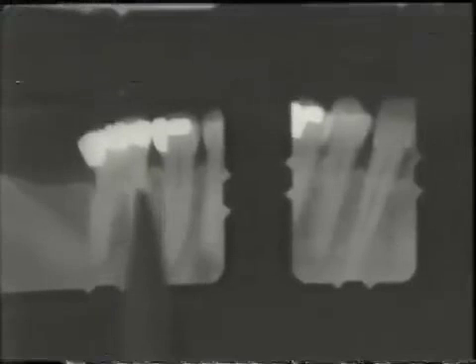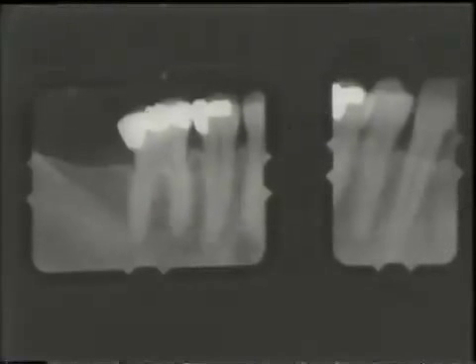Going all the way across to the remote abutment — the molar abutment — we see that there is only a moderate degree of bone loss on this terminal abutment. So on both terminal abutments we have moderate degrees of bone loss. There has been an active periodontal condition in this patient at one time, which now seems to be arrested.